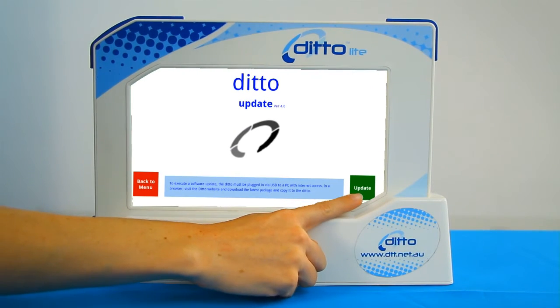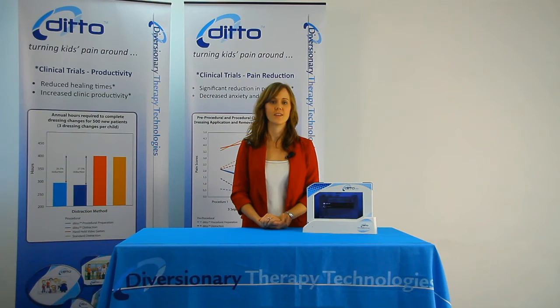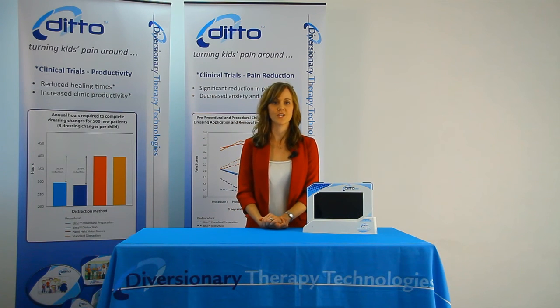Next, press the update button on the Ditto screen to install the new update file. Once completed, please restart the Ditto. If you have any questions, please contact your local Diversionary Therapy Technologies support member.